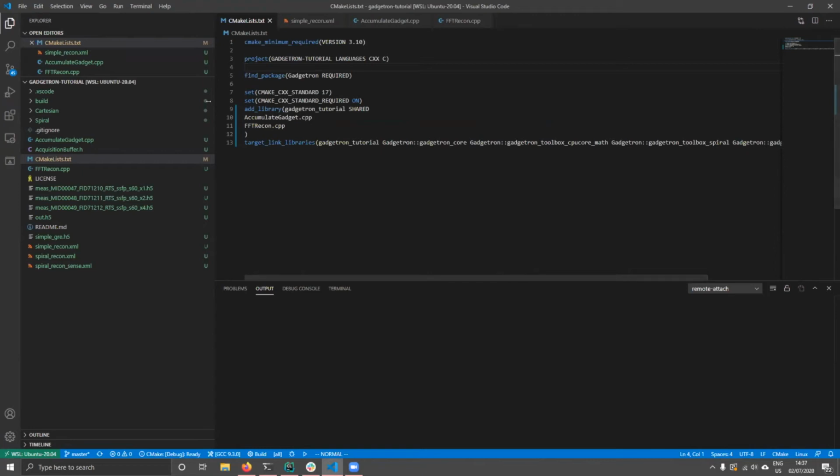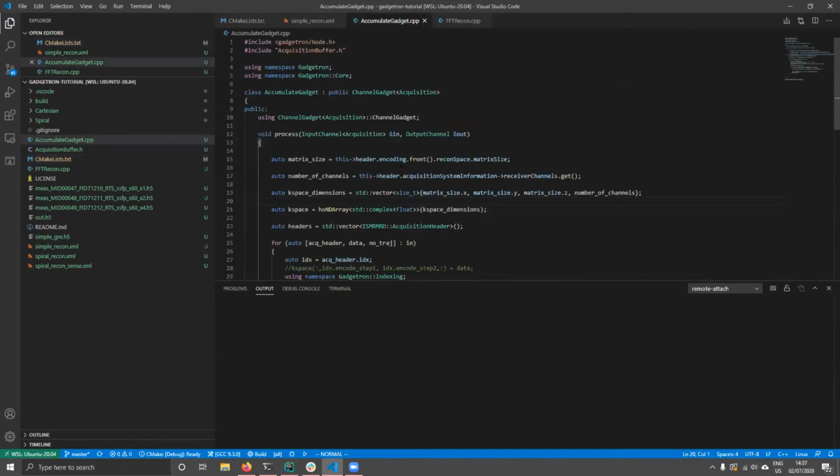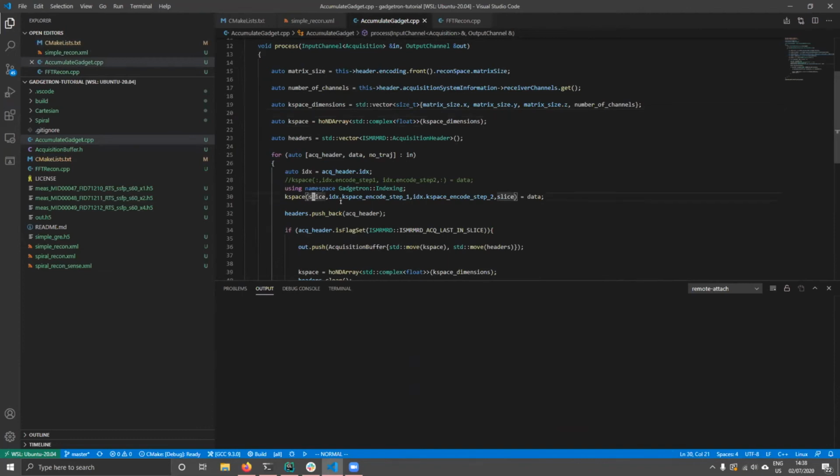Slice, like in MATLAB. Sorry? Can you hear me? Yeah. When you enabled slice, yes, slice is now a reserved word that lives in Gadgetron indexing. So what you could do, you could also do indexing slice instead. So that would also work. I just do it the other way because this is quite long. So the slicing works, like it is a limited version of the slicing you have in Python and MATLAB. We can only do slicing like this. We can't do, you know, from some point to another point, that sort of slicing.